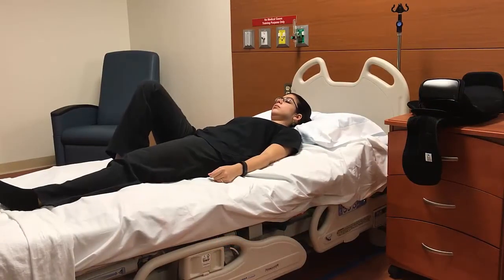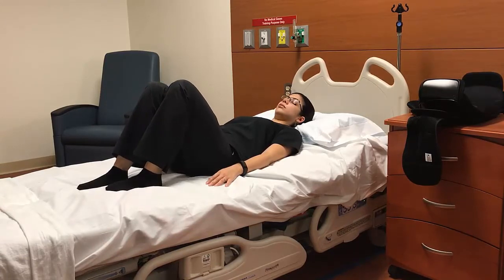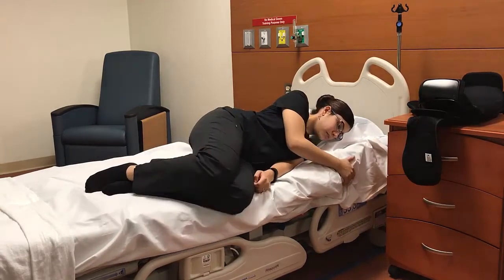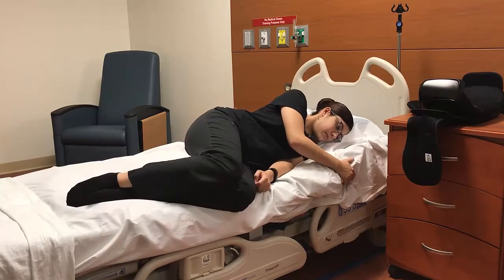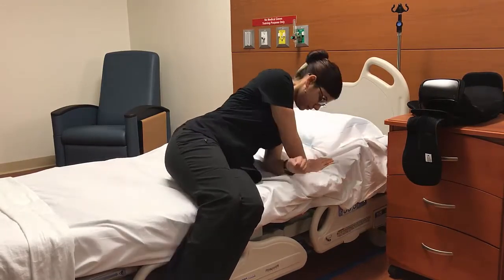Before putting on your brace, come to sitting at the edge of the bed using the log roll technique. Bend your knees, reach across your body, and roll onto your side, keeping your shoulders and hips in line. Scoot your legs off the bed and push up with your arms.